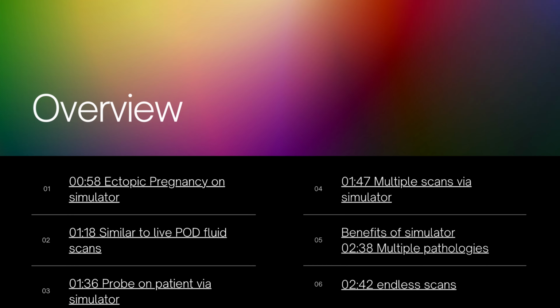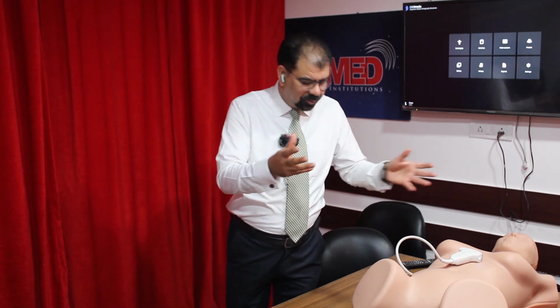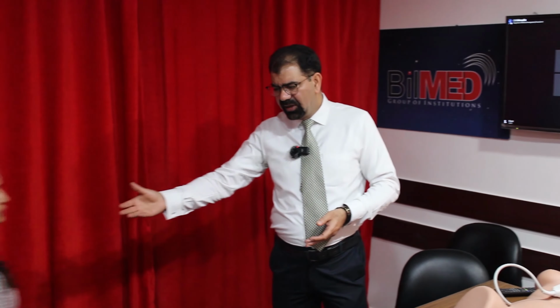Today we will give a short demo of a simulator. Now, what is a simulator? A simulator is an ultrasound machine with a patient. I am repeating, an ultrasound machine with a patient, where this patient will behave like a patient with a pathology, whatever you want.